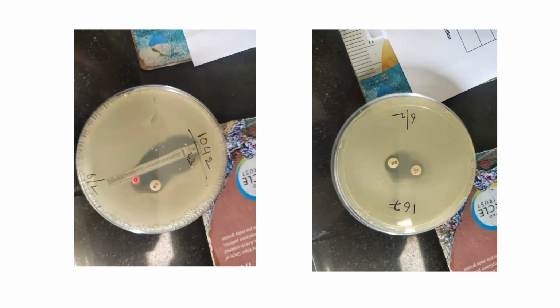Here, on the other side of the E strip, can you see this? Yes, that's where the zone of inhibition starts. That's how you read the MIC for that given antibiotic for that given bacteria. So here it's 1, so it is within the sensitivity limit. This is how I would read the report: ceftazidime avibactam as an individual is sensitive, aztreonam individual drug is resistant, and there is a synergy of ceftazidime avibactam and aztreonam. So that's how the report would be.